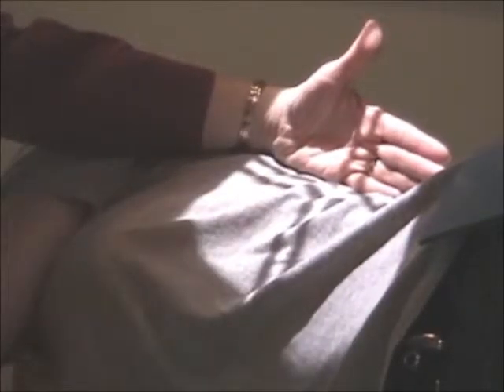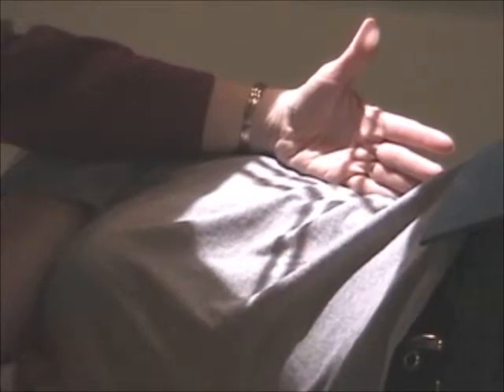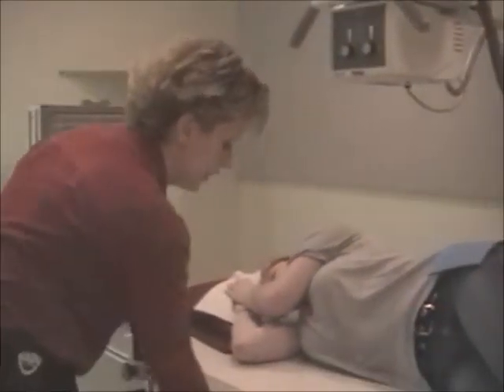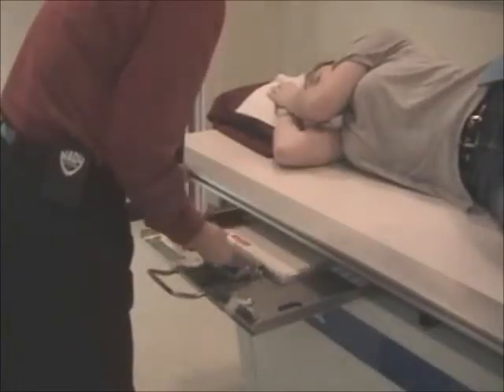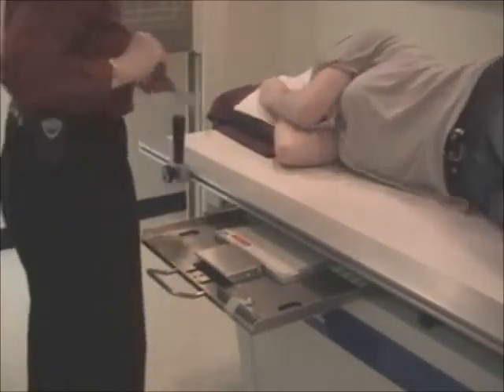Mid-coronal plane, you should be anterior to the mid-coronal plane approximately 1.5 inches, but since we were showing tabletop here, I actually moved the patient this way to include more of the body. And this would be a right lateral. Change cassettes, and I'm going to go crosswise, and we're going to have the patient roll onto their stomach.